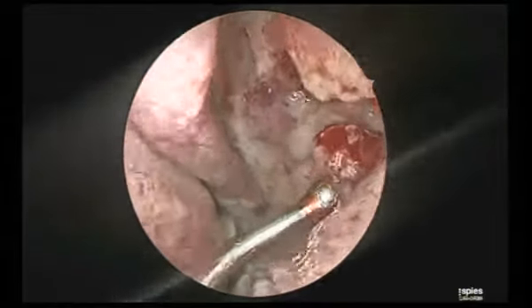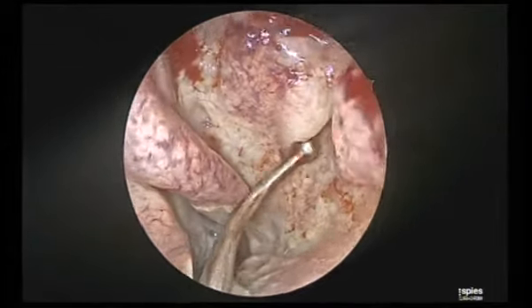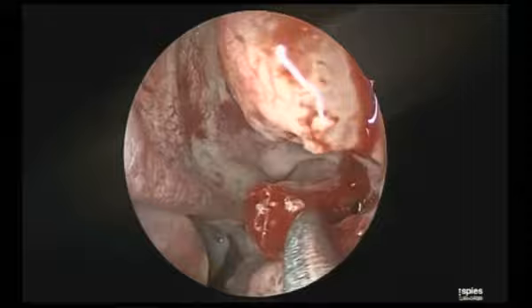This is the lower horizontal part. See, this goes very nicely behind to a variable extent. Sometimes it ends up over here in the mucosa of the fontanelle, and sometimes it goes up to the perpendicular plate of the palatine bone. Now with my ball probe, I am fracturing the lower part.